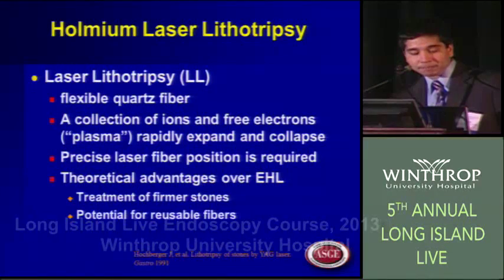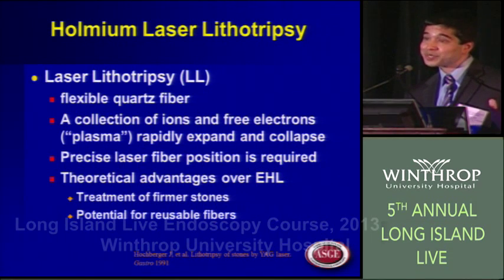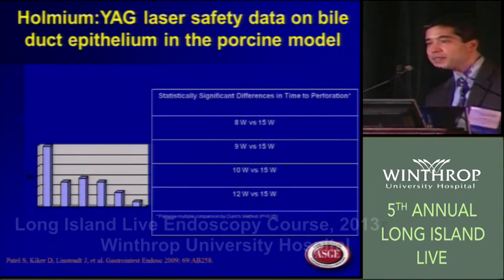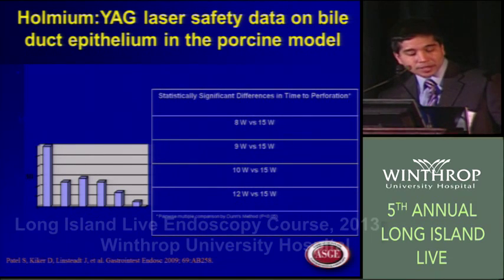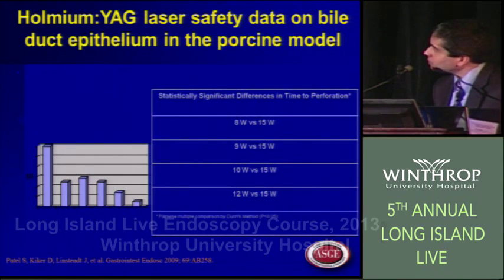Now, whether laser lithotripsy, I don't know if any of you use laser lithotripsy in your practices with cholangioscopy. So I'm just going to go through. There's some interesting data. Sandeep Patel from UT San Antonio did some bench testing using laser, putting it up against the porcine bile duct, and really seeing significant differences in time to perforation.